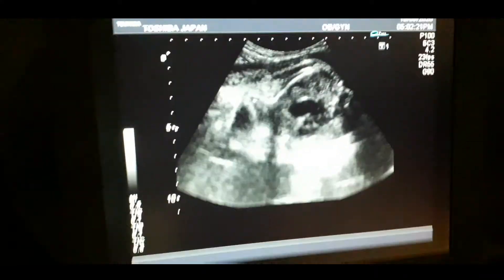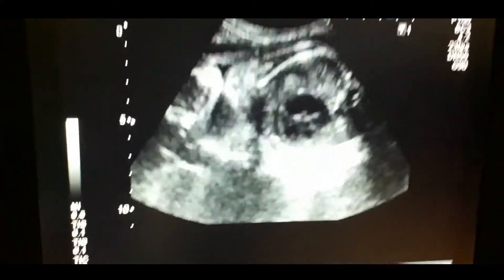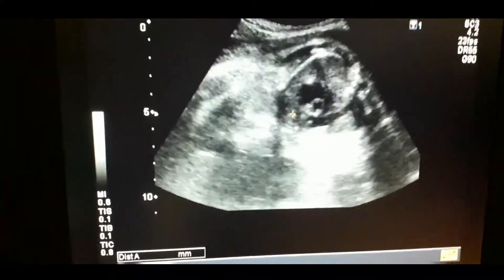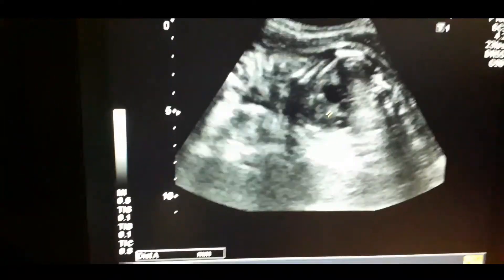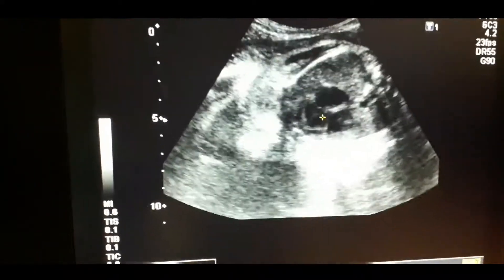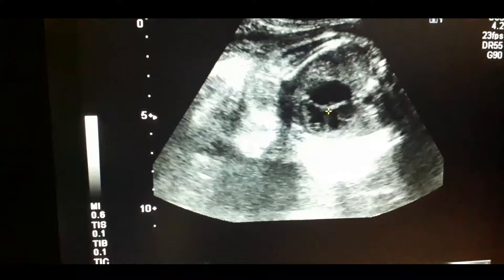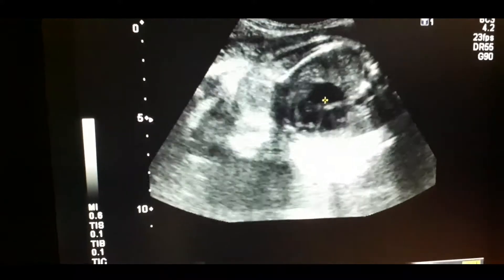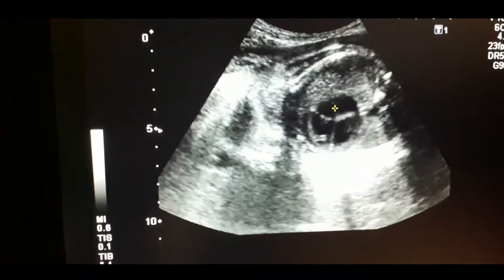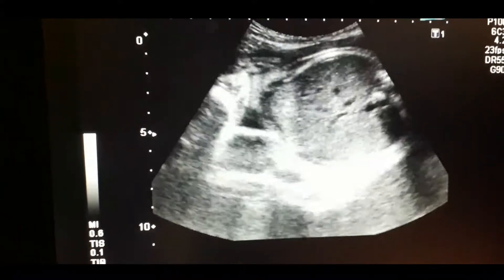Coming to the live case, this is the fourth chamber fetal heart. You can appreciate the atria and deficient inter-atrial septum.